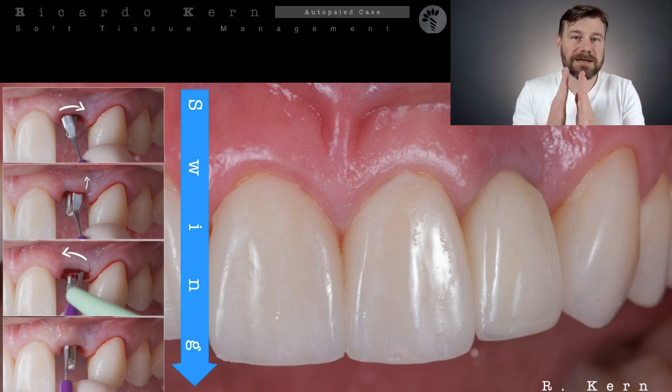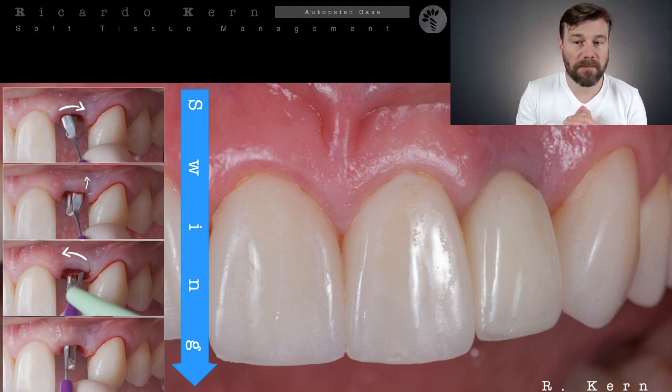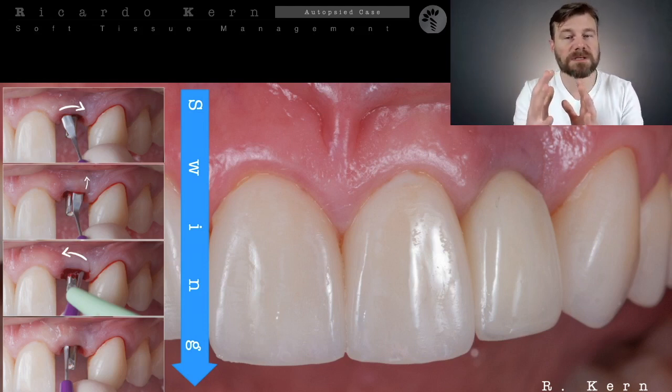Once you start to split this area, you can make this tissue a little weaker, because you can compromise some of the blood flow on this flap, and you increase the risk of some necrosis on the surface.